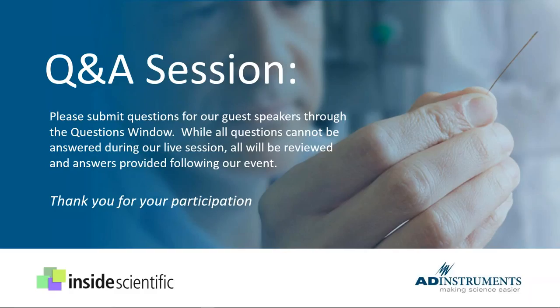Sure. The alpha or the stroke volume, they're essentially doing the same thing. If you're going to derive your alpha from a cuvette, the cuvette will give you the same value each time, the only variability being the resistivity of the solution and the placement of the catheter.